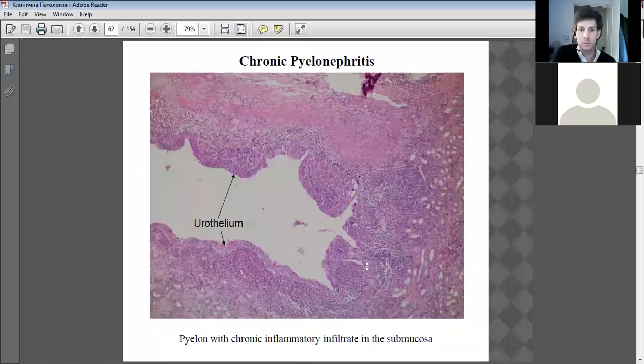Let's move on to one last slide. You get the surface of the structure beginning to degenerate and break down, with lots of holes forming, necrotic patches. Some areas, perhaps that area is still a bit normal, but most of it is rough, broken down areas. Okay, massive inflammation. All these purple dotted bits are inflammation all over.